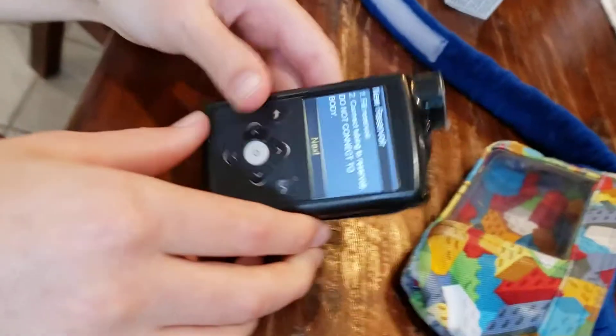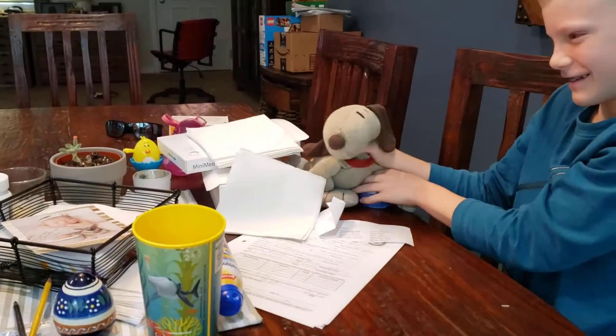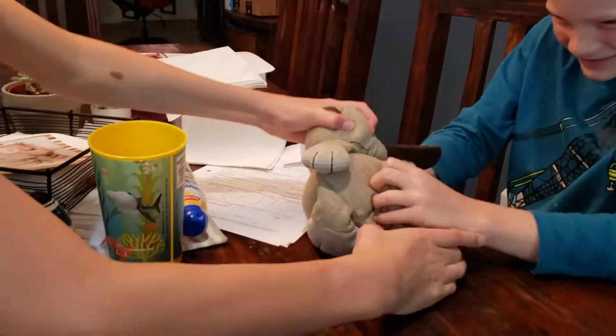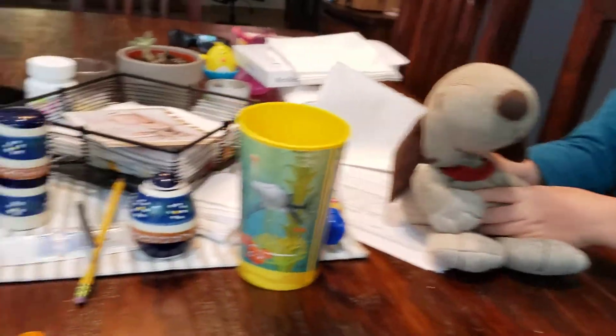What do the instructions say now, big guy? It says fill reservoir, connect tubing to reservoir. So I need the little meal from this dog. This dog causes so many problems in our house.